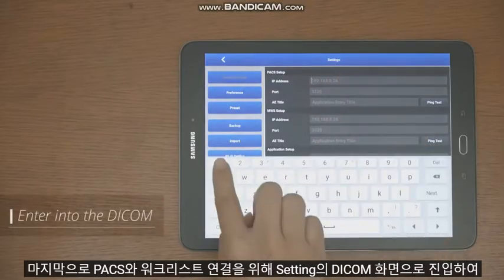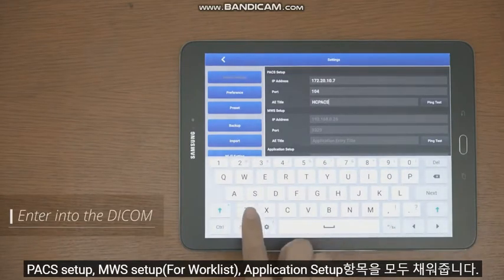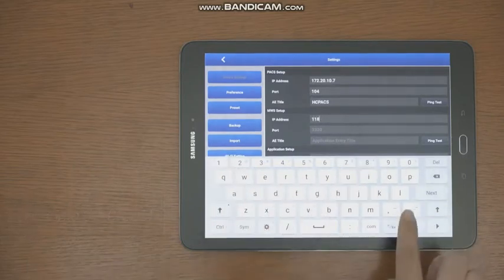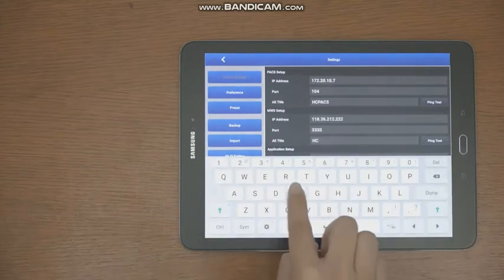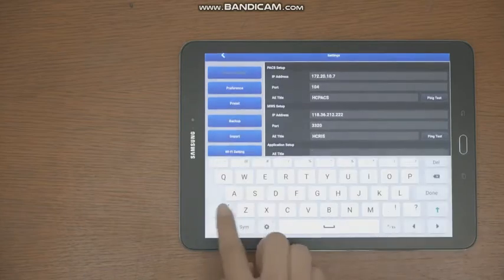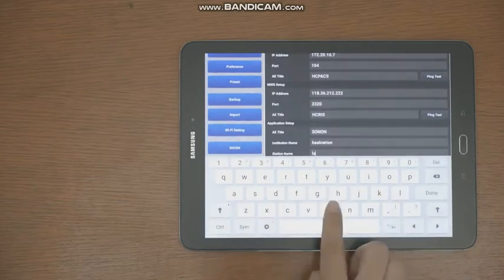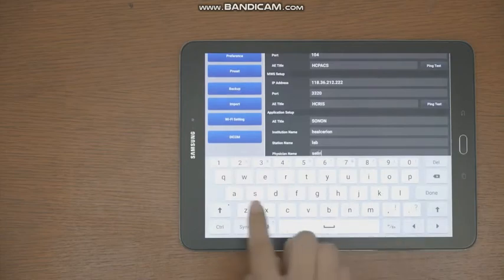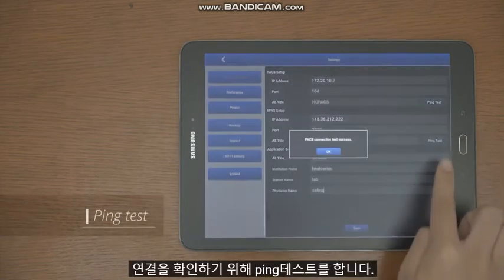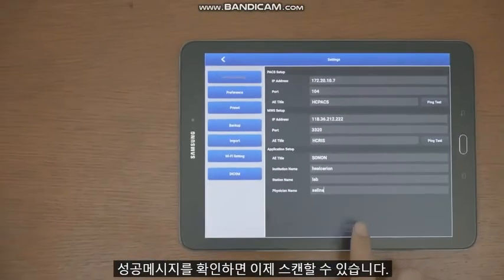Finally, to connect the worklist with PACS, enter the DICOM screen and fill in the PACS Setup, MWS Setup, and Application Setup items. Perform a ping test to confirm the connection. Once you see the success message, you can now scan.